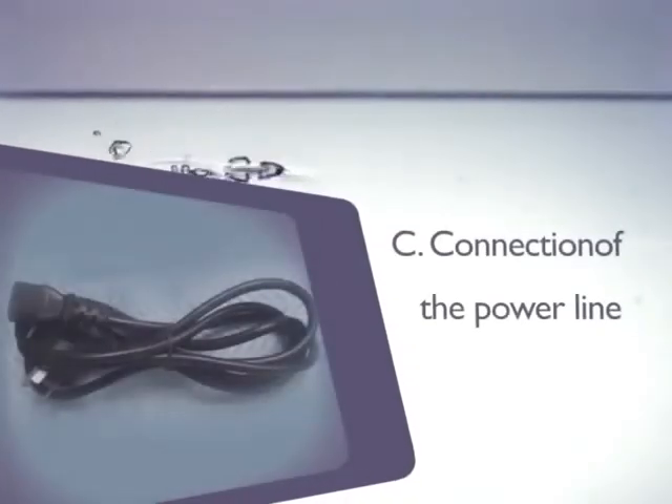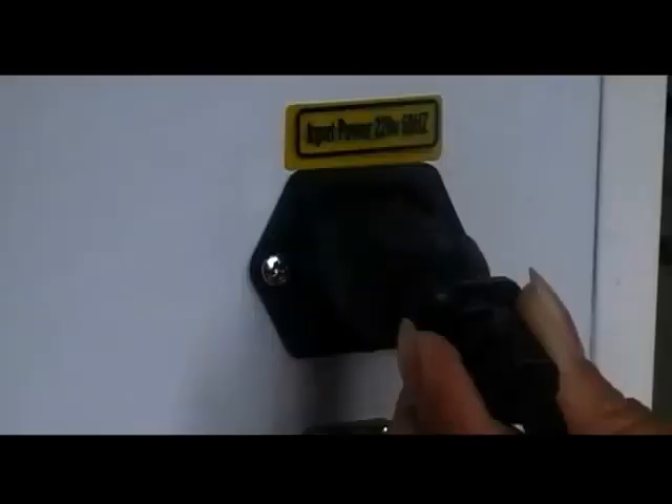Connection of the power line: plug in the power line.